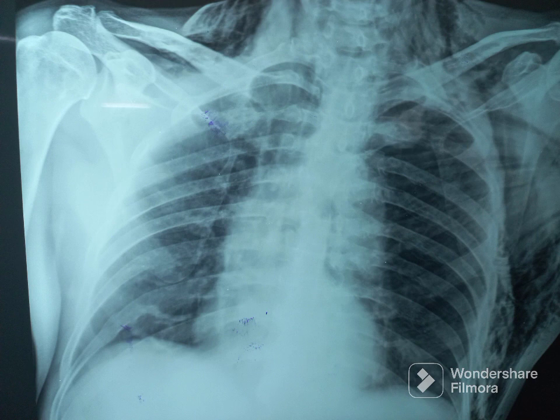This patient presented with dyspnea to the emergency room following a road traffic accident. You can see the dark shadows in the soft tissue around the left rib cage and in the neck region. These dark shadows are pockets of air in the subcutaneous tissue.